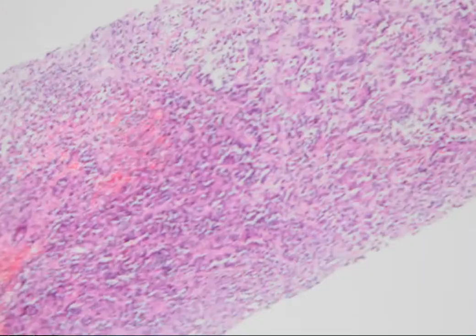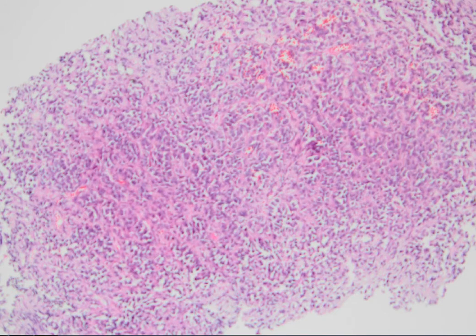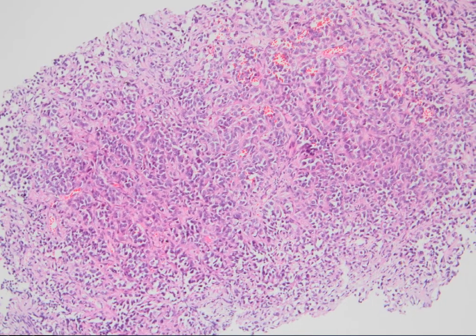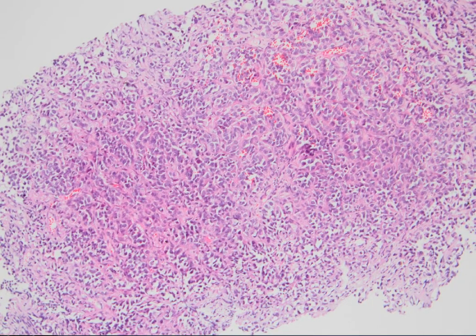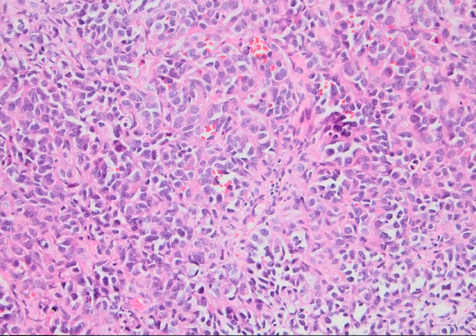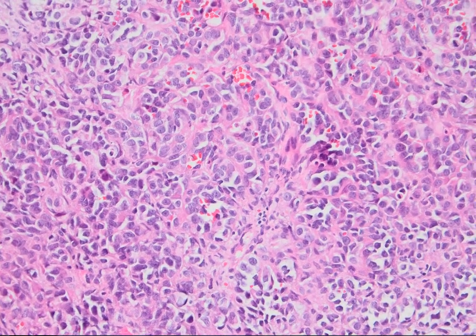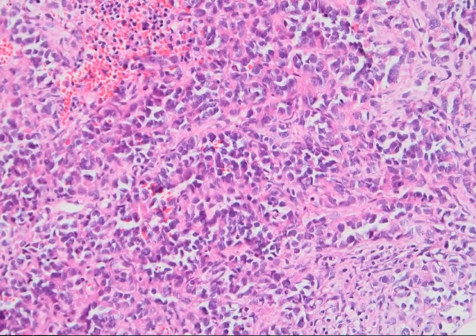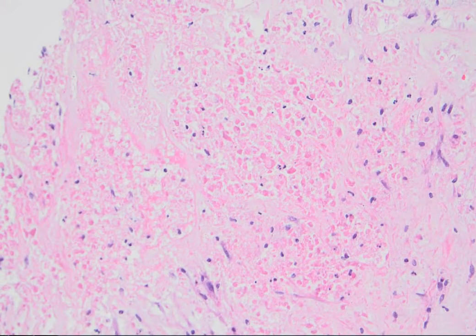I'm not going to go into details, but I'm just going to show the pattern. We have this vaguely nested pattern of epithelioid cells. They are ugly looking. They have many mitotic figures, and we also have necrosis. Here is necrosis.